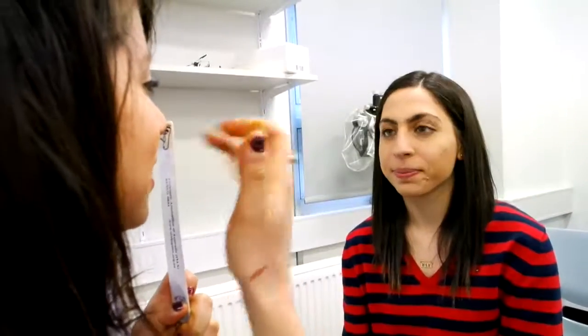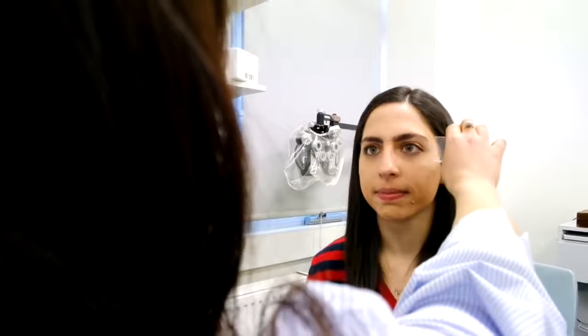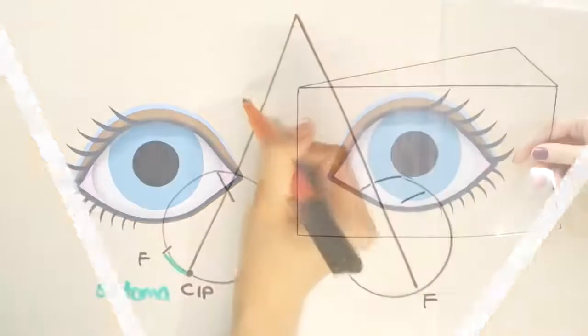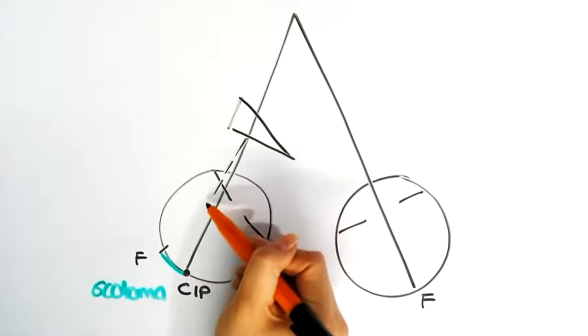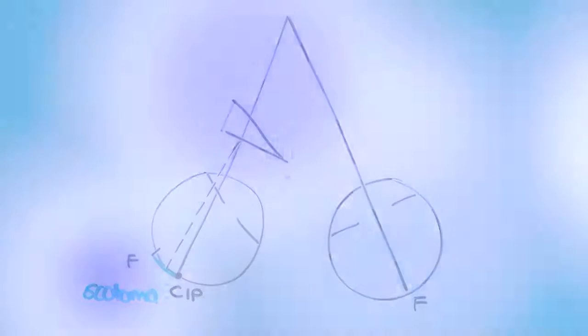Just going to get you to look at the top letter over here for me. When we place the prism on the deviating eye, you will see no movement from either eye. We don't see movement here as the prism just moves the image onto the suppression scotoma. Therefore, there is no drive for the other eye to make that conjugate movement.